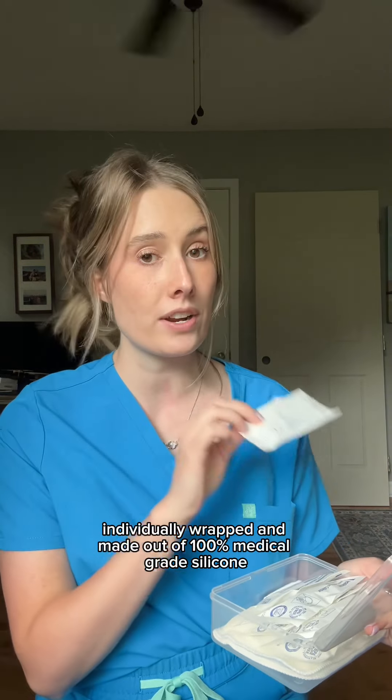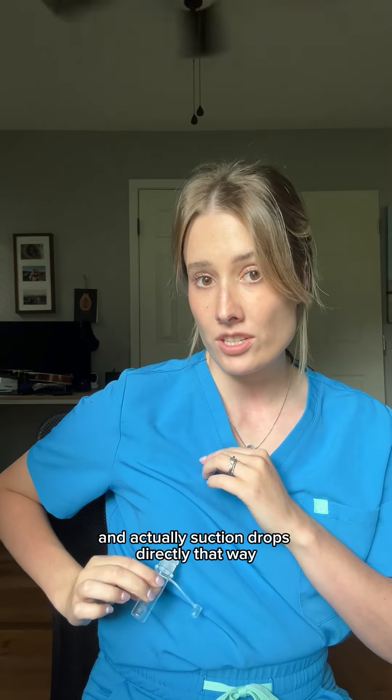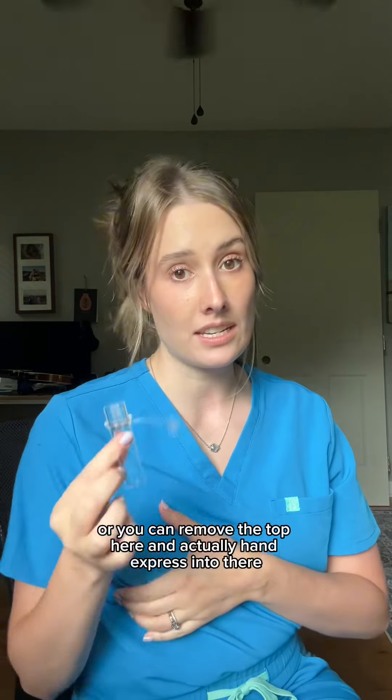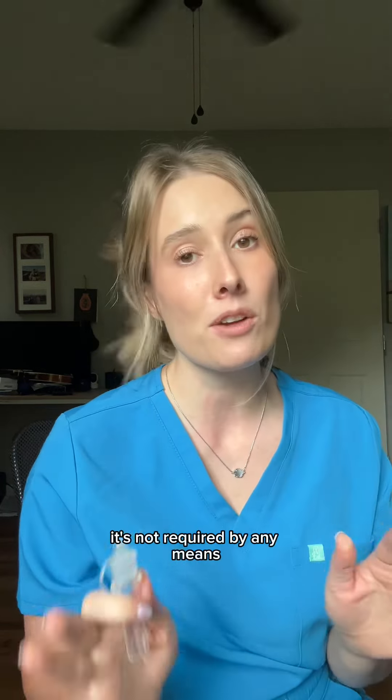There are two different ways to collect colostrum with this. You can remove the little top here and actually suction drops directly that way, or you can remove the top and hand express into it. I've had tons of patients bring in refrigerated or previously frozen breast milk.